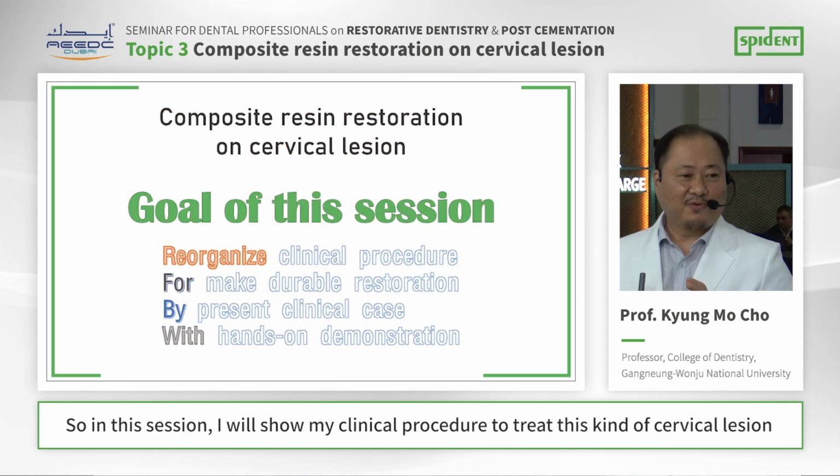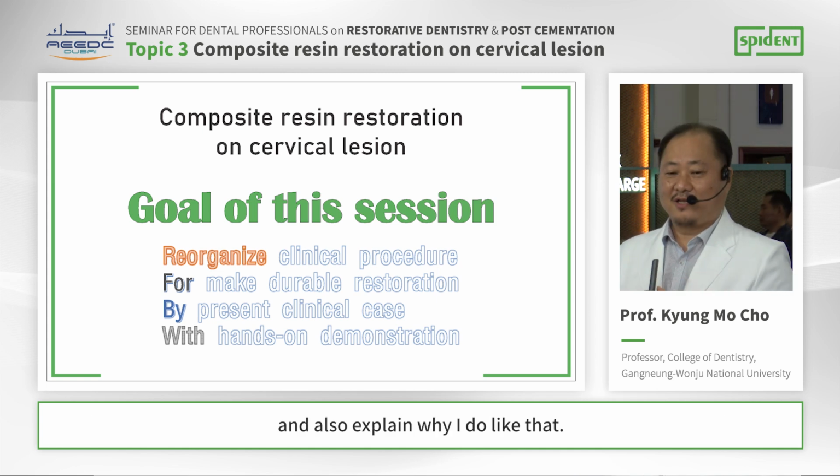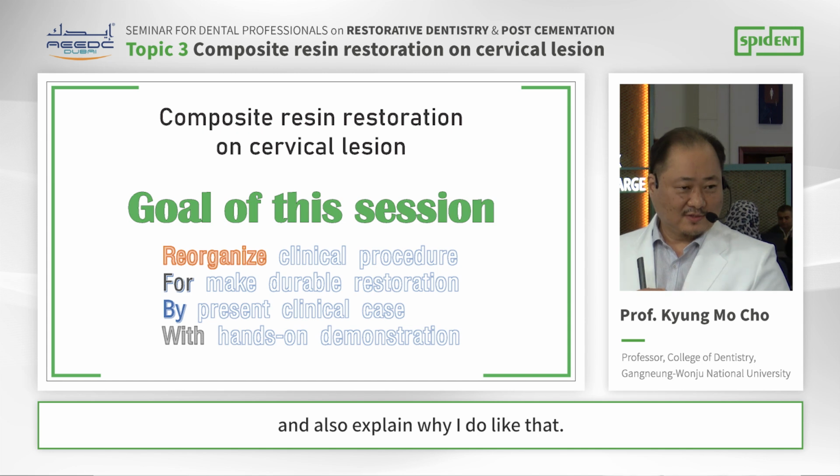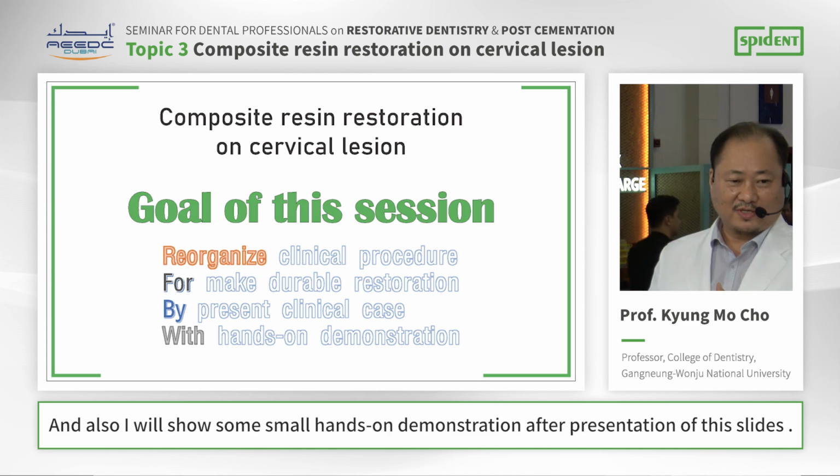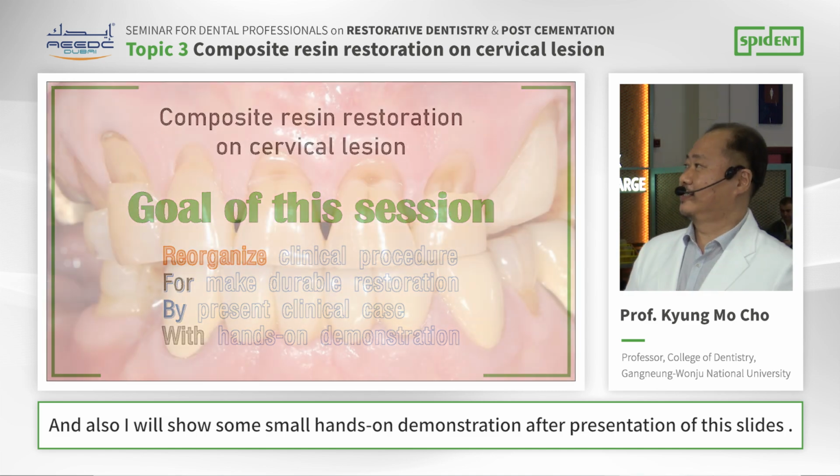So in this session, I will show my clinical procedures to treat this kind of cervical lesion, and also explain why I do it like that. And I will also show a small hands-on demonstration after the presentation of this slide.